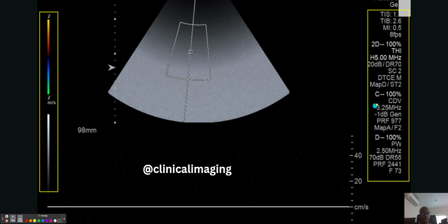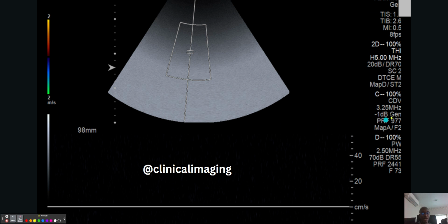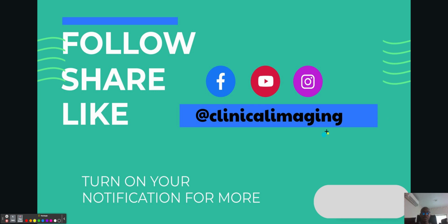So always take a look at your screen. All this information is for you, the user. It is very, very vital. You need it. You don't need to look away. And that is why we're having this tutorial so that you will understand what your screen is showing you.